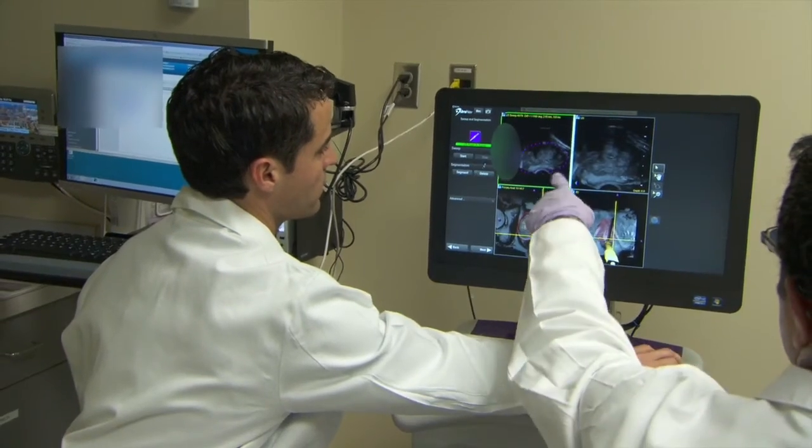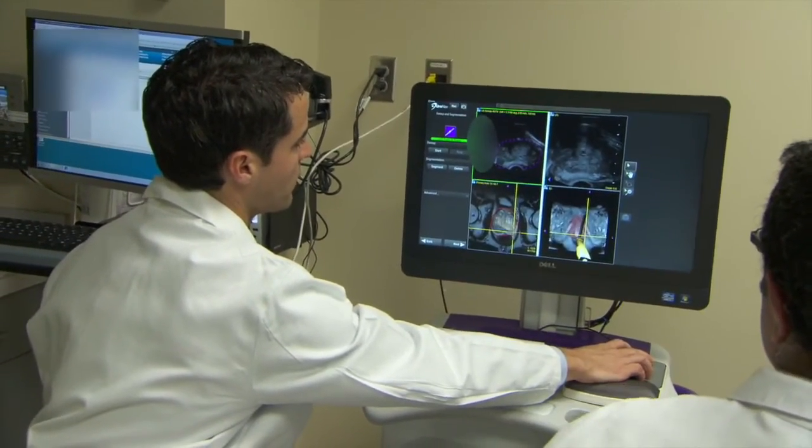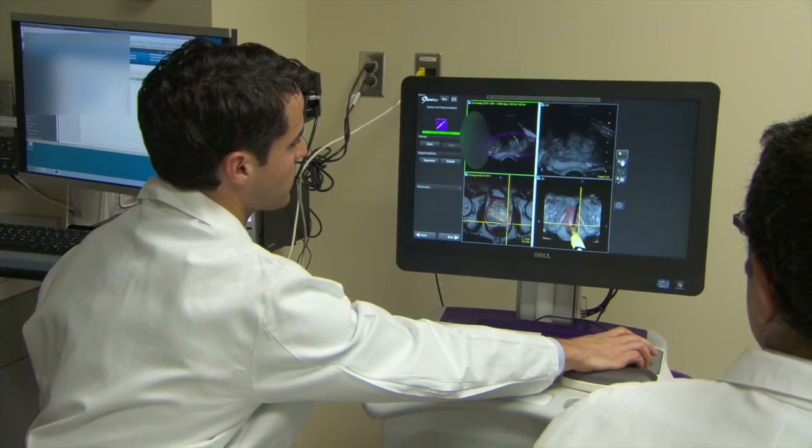So the reality is that MRI for prostates has been around for a long time. However, with the advent of newer technology and improved recognition of different sequences and the realities of tissue that is cancerous versus tissue that is benign, has allowed us over the last 5 to 10 years to really get a better sense of those abnormal areas and really improve the sequencing as well as the improved magnet strengths.